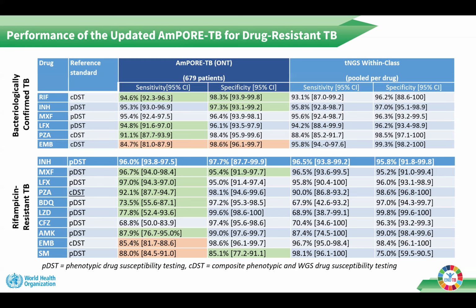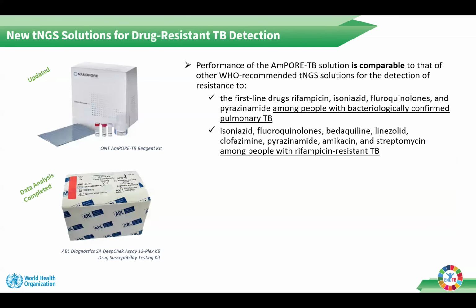in orange. And what you can see is, based on the software update for this solution, it overall saw increases in performance for rifampicin, the fluoroquinolones, pyrazinamide, bedaquiline, linezolid, and amikacin, while experiencing a slight decrease in performance for ethambutol compared with the overall class.